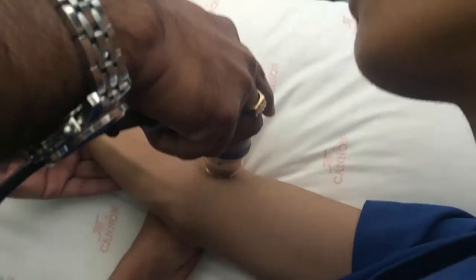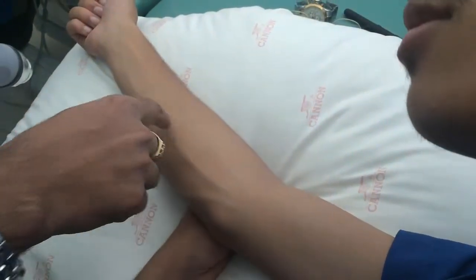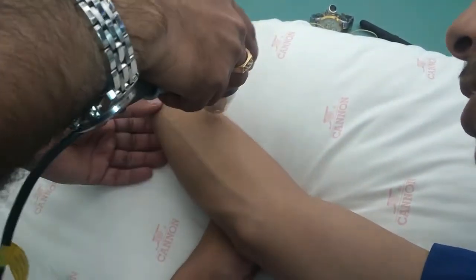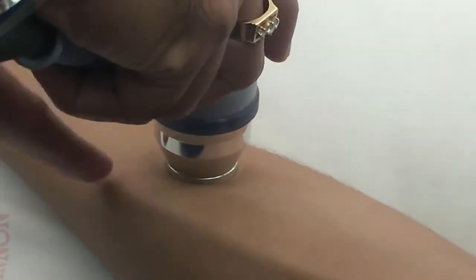For example, if the patient is coming and this whole area is painful, I am making small boxes in a grid. I will be touching the tip of the laser to the skin, perpendicular. I will not be pressing tightly, I will just be touching it.